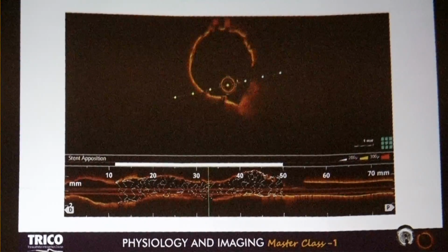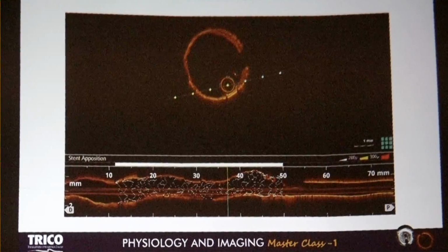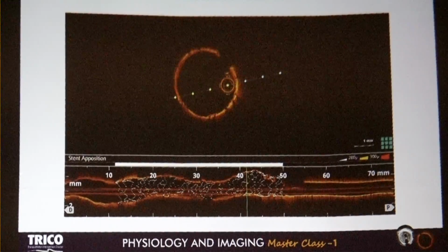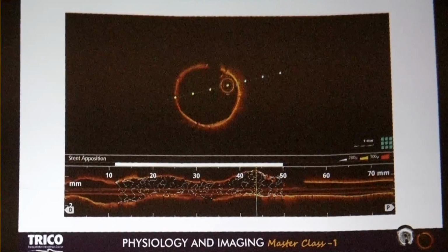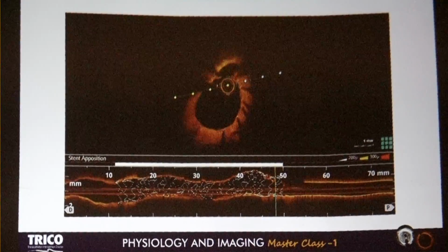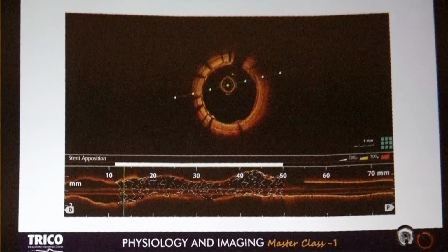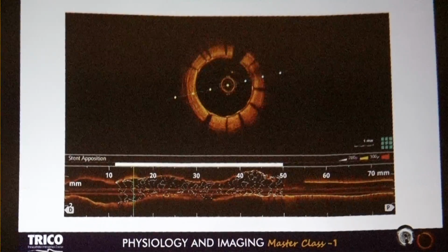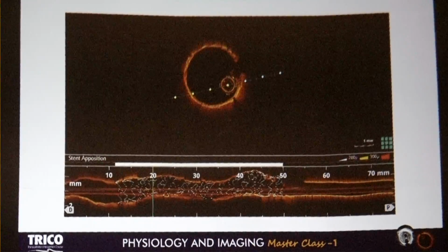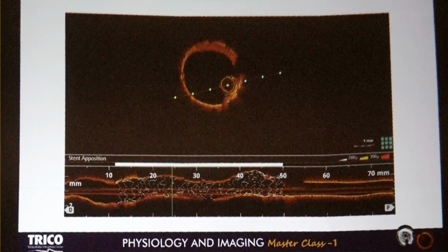And then there is some sort of overlap of the stent which shows some proliferation, extremely acceptable type of proliferation. And so now it is almost 2.5 years follow-up. Patient is doing fine. But yeah, this was a very gratifying intervention, where we were able to exclude the aneurysm and getting encouraged with this.